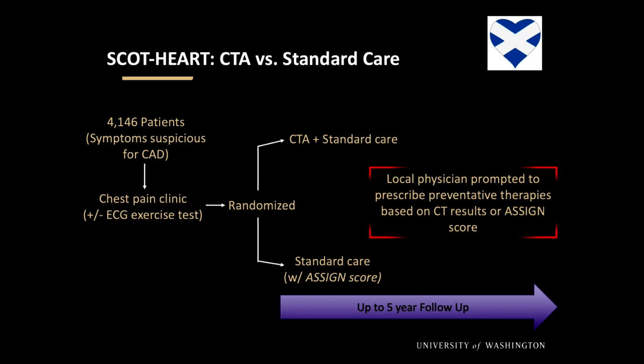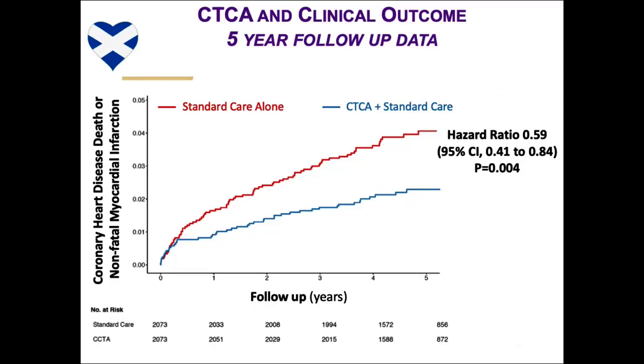And one of the key differences here is that in this trial, the CTA results were given to the providers with specific recommendations on what to do with the results. And there was also prompting from the central trial committee to prompt the providers to act on the results of the CTA. So they followed them up for about 5 years, and these are the outcomes that they saw.